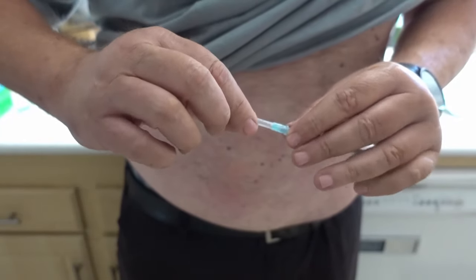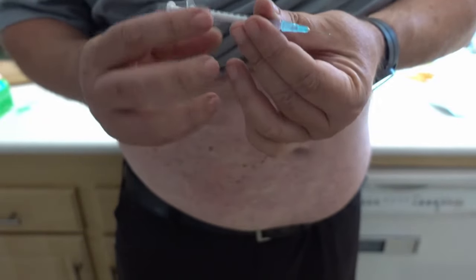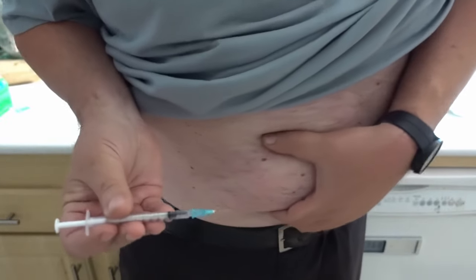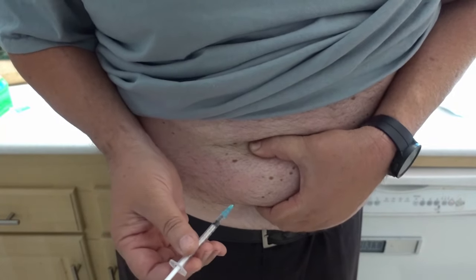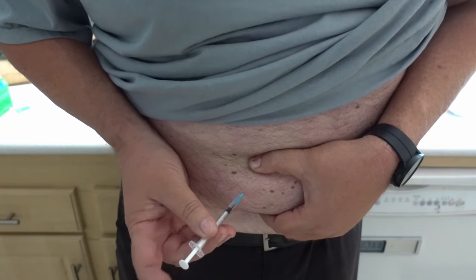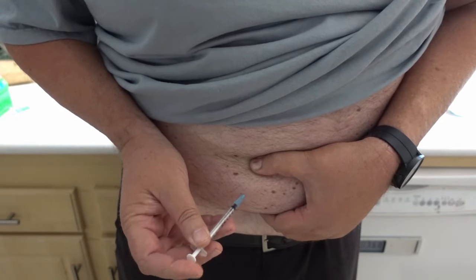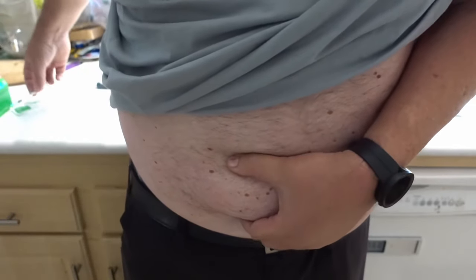Then take the syringe and pull the cap from the syringe. This is already loaded, so go ahead and pinch the area, do the injection, press the plunger, and pull it out. That's all there is to it — I didn't even feel it. Thank you.